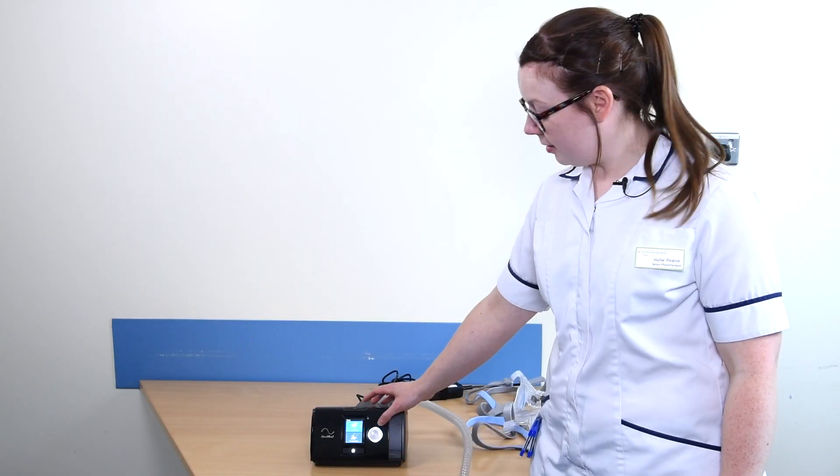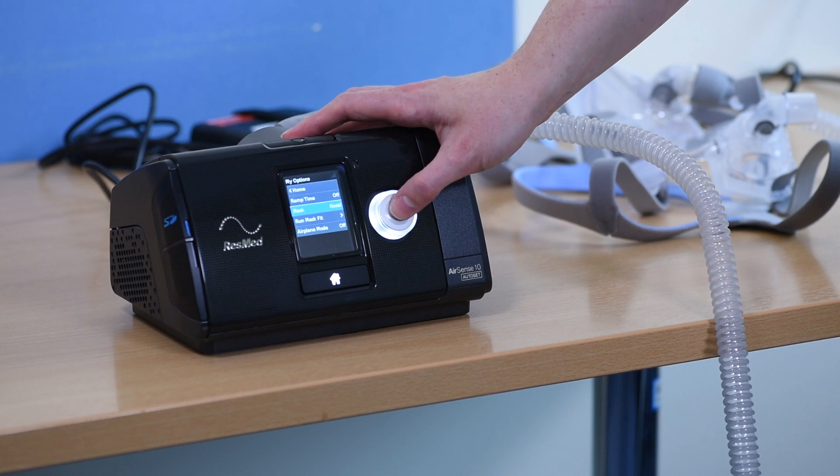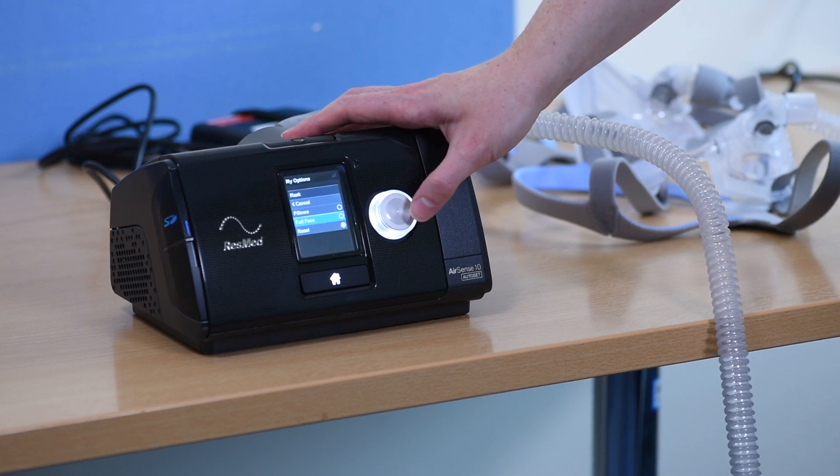When swapping between mask types, go to the My Options menu, scroll down to Mask, and select the style of mask that you are using.